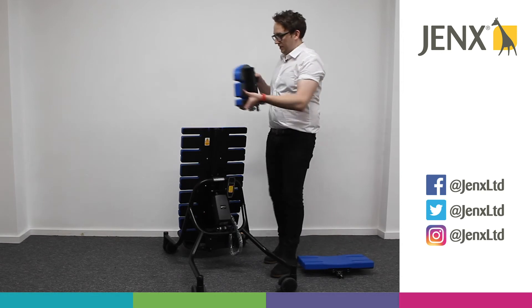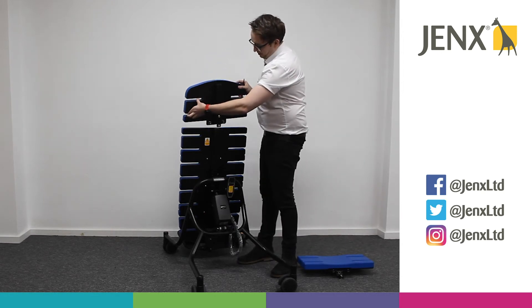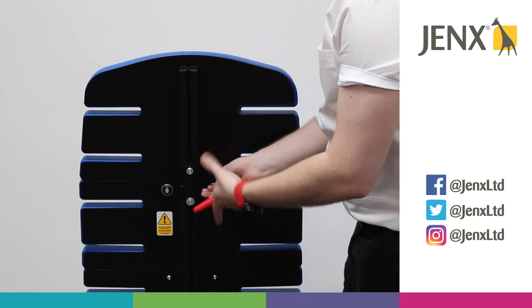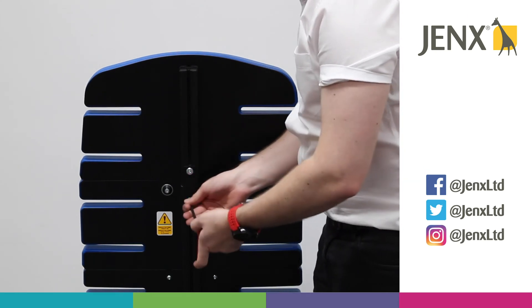If you'd like to put the top one back on for aesthetic purposes, you can slide that on and then tighten the support boards back up.